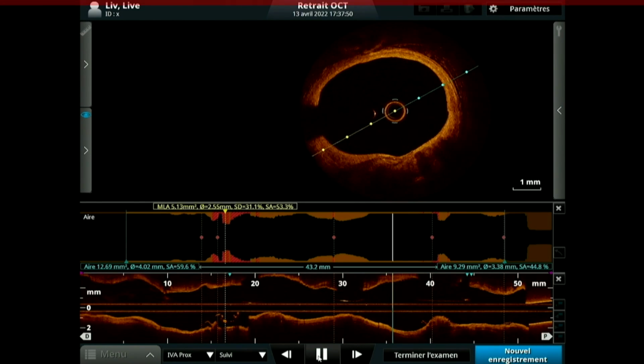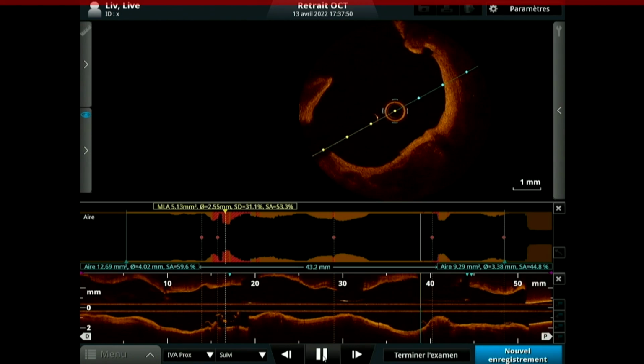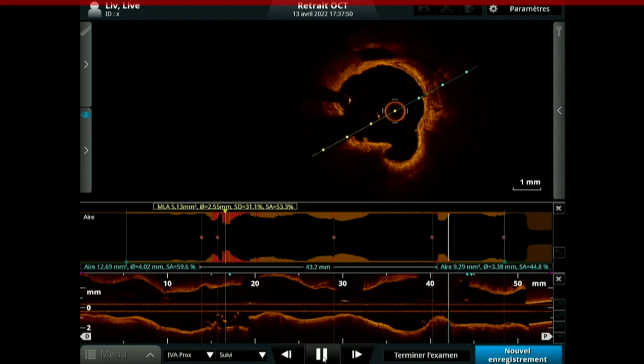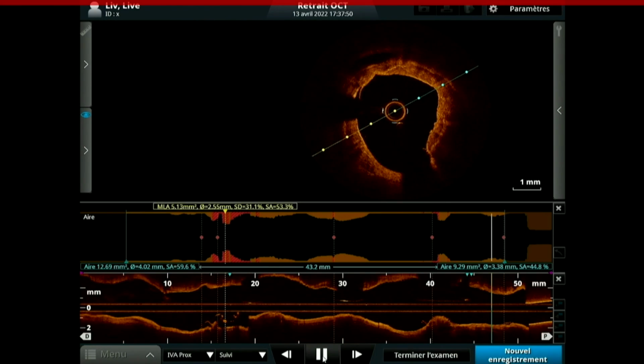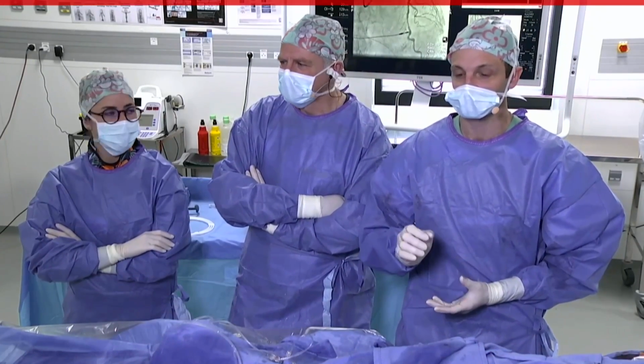When we go on the left main distal lesion, there is a perfect improvement of the lumen without any dissection, and this is a very good result of preparation before stenting, and probably it would be enough. If we focus on the mid-LAD, there are interesting points.